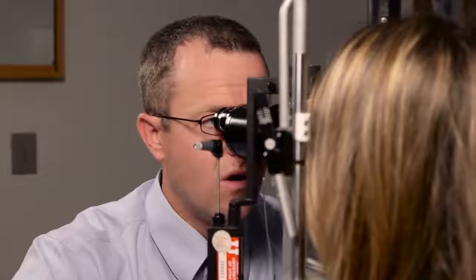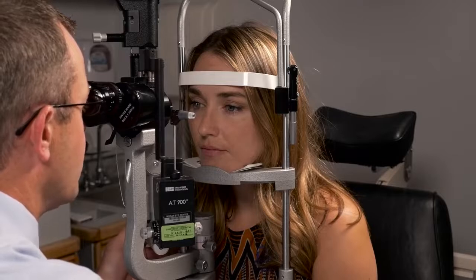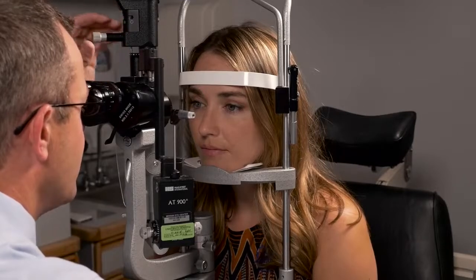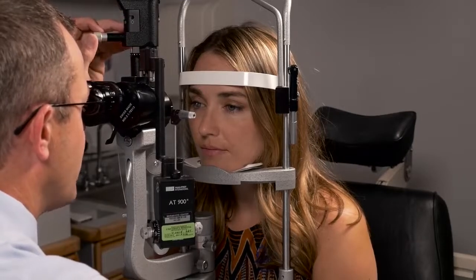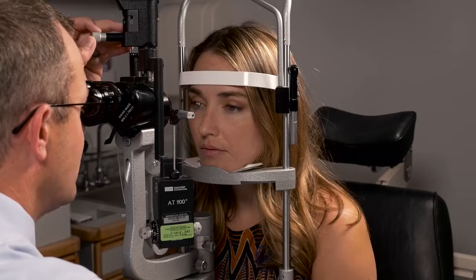After the cornea, you're going to look at the anterior chamber, and in the retina world, we do a lot of uveitis, or inflammation inside of the eye, exams. To look in the anterior chamber, you're going to narrow the beam, make it thin and narrow, and focus in on the iris. Once you have the iris border or the pupillary border nice and focused, you can pull back a little bit. Also, you want to turn the beam up, and by focusing on the iris border and then pulling back just a little bit, that will allow you to see if there's any inflammation in the anterior chamber, and this patient doesn't have any inflammation in her anterior chamber.